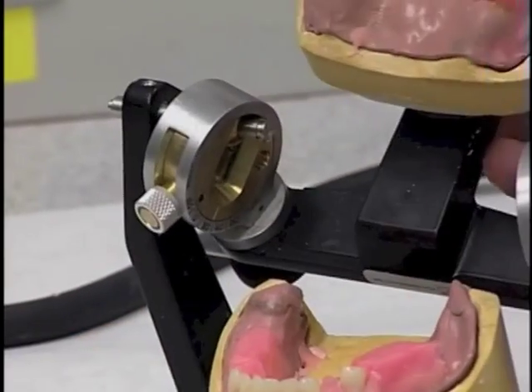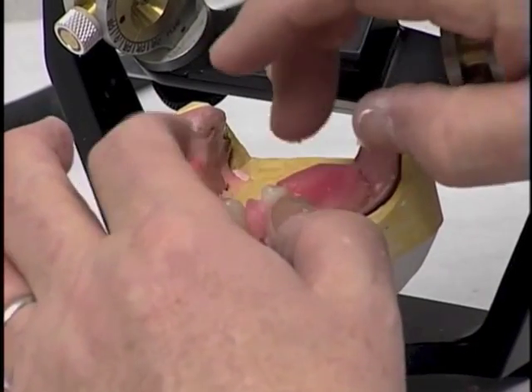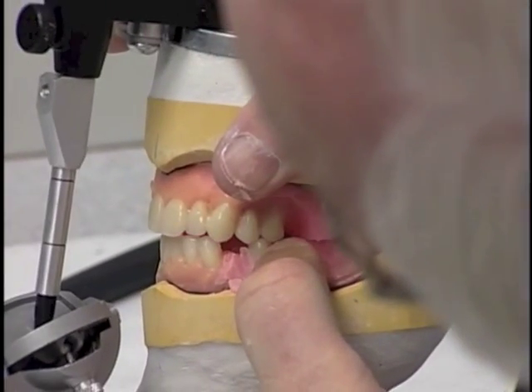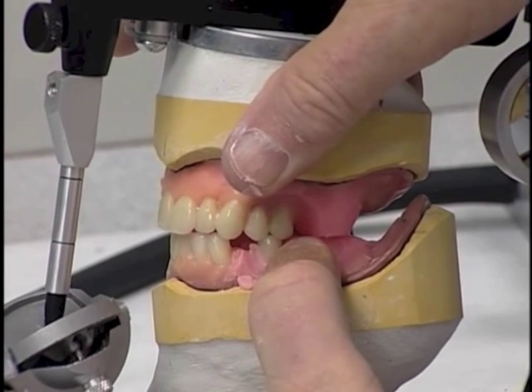It's getting close. So we close it in centric relation, and we see that the buccal cusp tip is fitting right into that embrasure as it should.